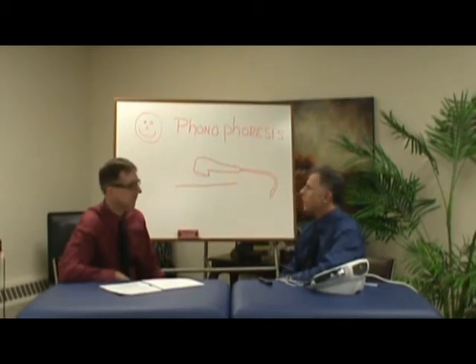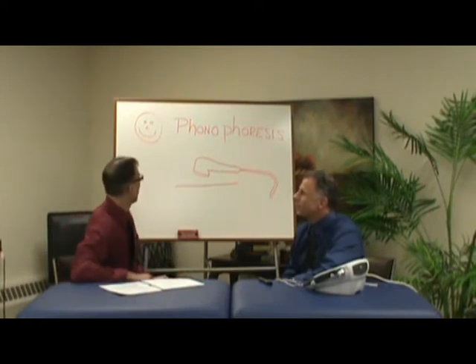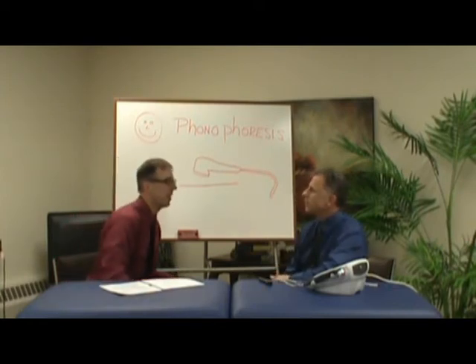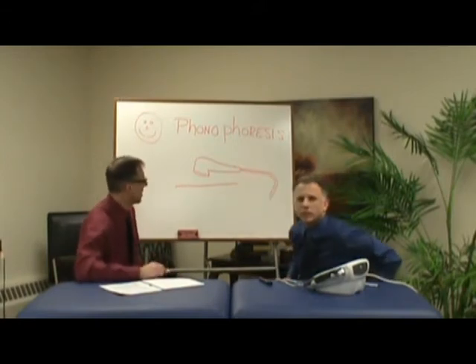And don't get scared. I talk to patients. I say, well, we could try some phonophoresis on your shoulder or your elbow, and they look at me like, phonophoresis, it sounds like a very terrible word, doesn't it? Right, yeah, an intimidating word. So let's break it down and find out what exactly phonophoresis really means.